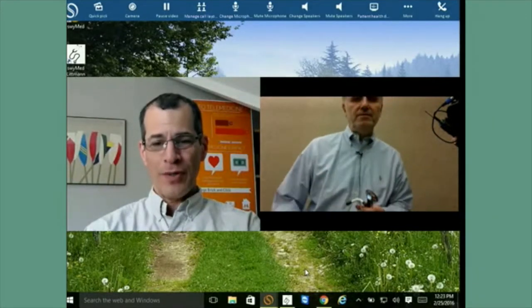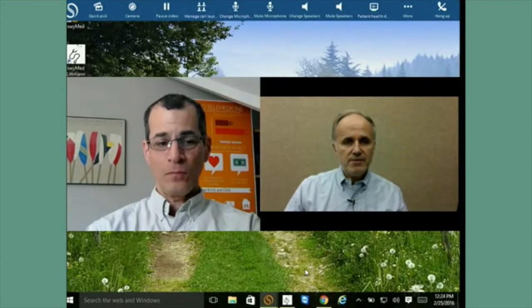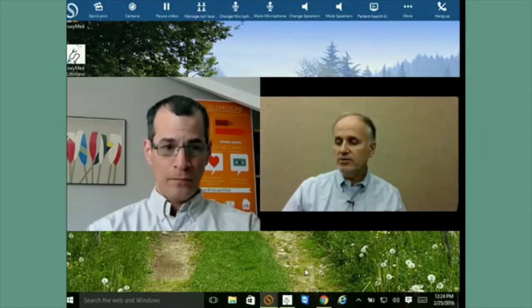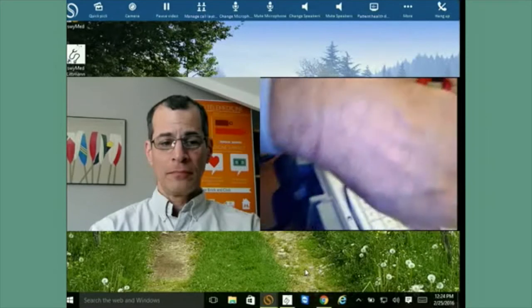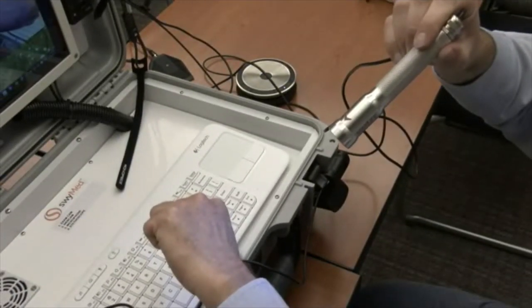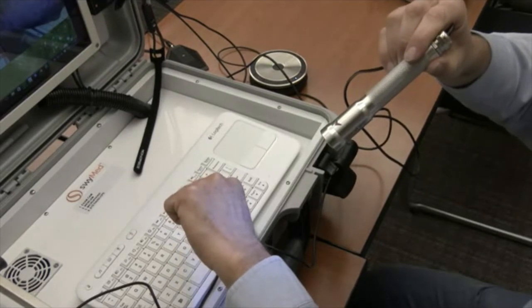Now we are connected with Jeff, who is acting as the physician. Jeff can talk to us, give instructions, and change the camera — for example, switching to the patient camera. He has control on his side, so there's nothing you need to do. I'm taking the XAM camera to point it at my hand. Note that the autofocus works best when you're not too close. If you get too close and lose focus, move a little bit away and it will autofocus again.